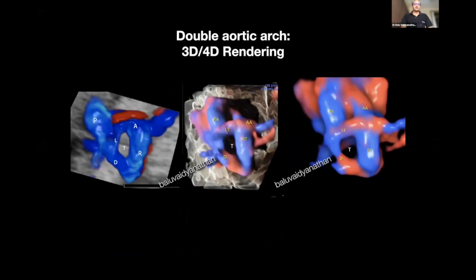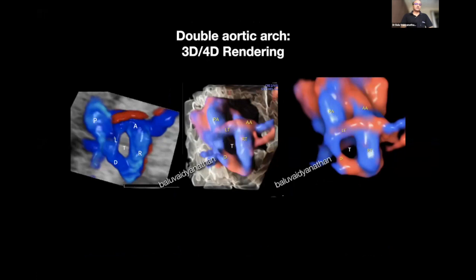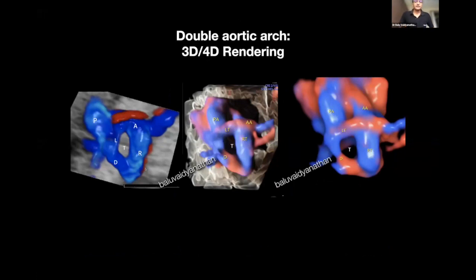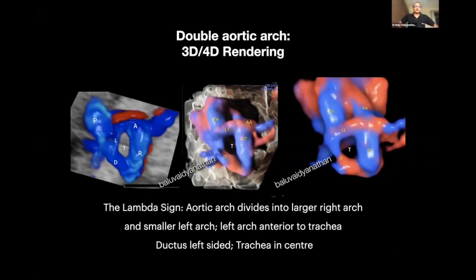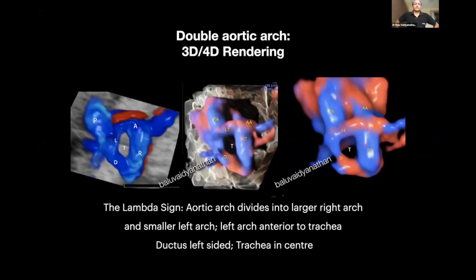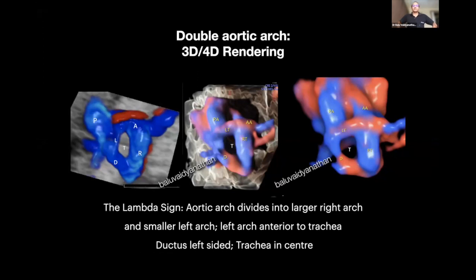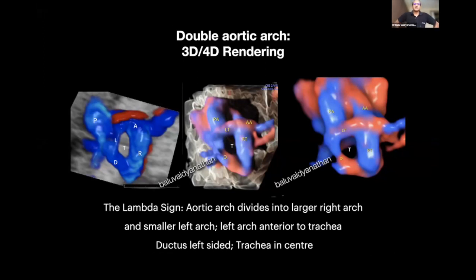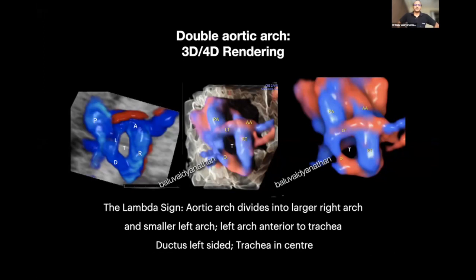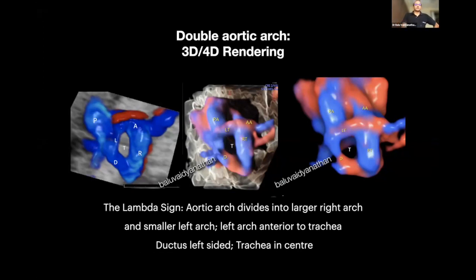In the 3D rendering you can clearly identify the right arch, left arch, and ductus, confirming it is a complete vascular ring causing airway compression. This is the classical example of double aortic arch. These fetal imaging pictures look very similar to postnatal CT pictures and are very useful to confirm the diagnosis and provide counseling.